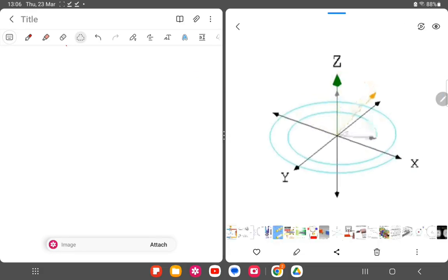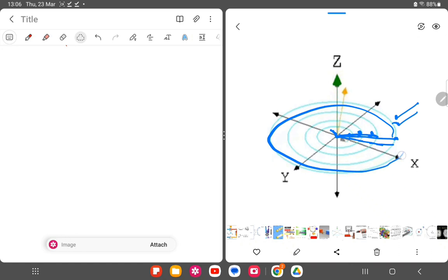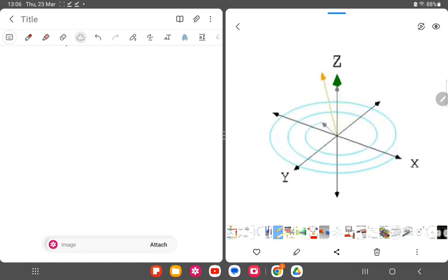See this, this is the video. See this horizontal component slowly coming down. It's coming down from maximum. This green color was maximum and then started going down. So the time this horizontal vector takes from maximum to minimum, from here to zero, is called T2, the transverse relaxation time.